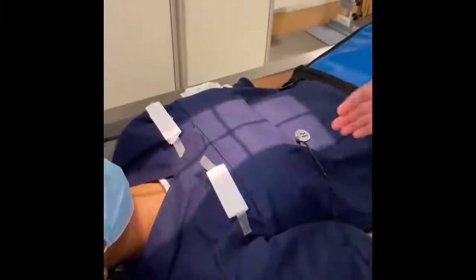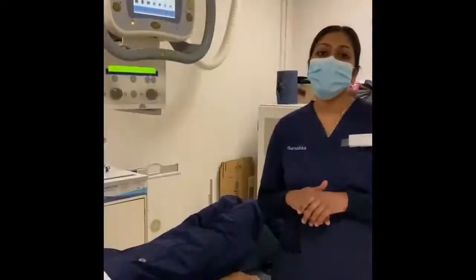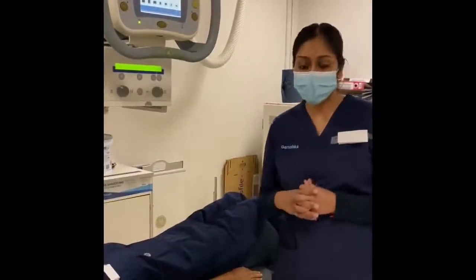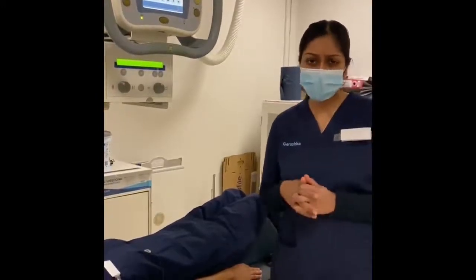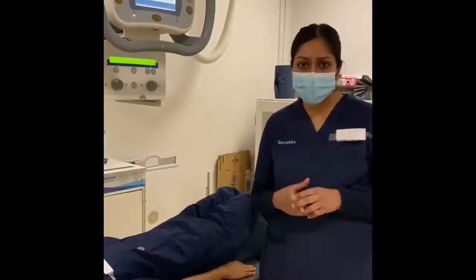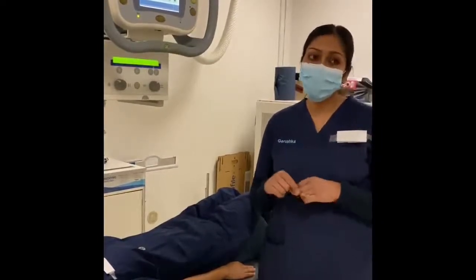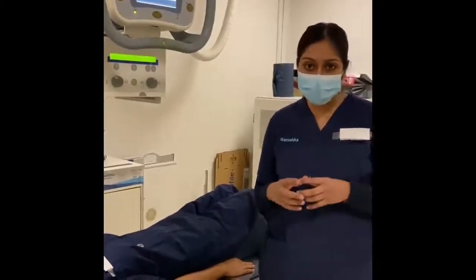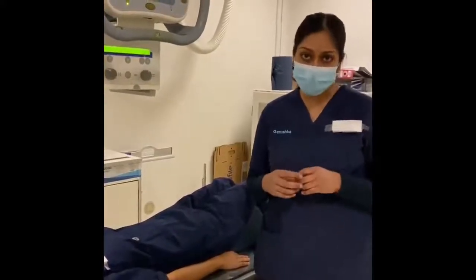So your marker needs to be readable either on the right or the left hand side. Okay, so with the exposure factors for your T-spine AP, it really depends on the system that you are using, whether you're using a CR or DR system. But more or less on average, I can say that you could use between 65 to 85 kV and between 32 to 40 mAs.